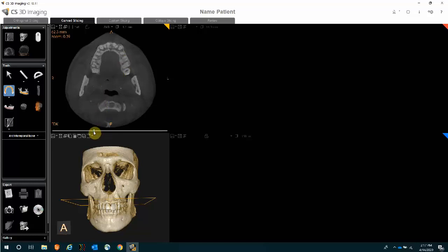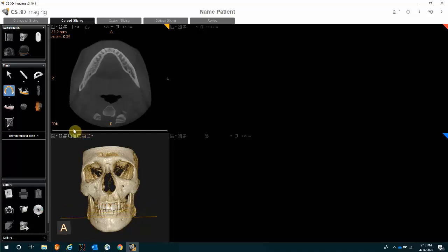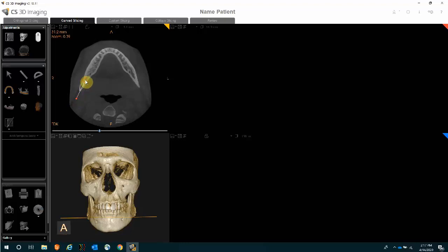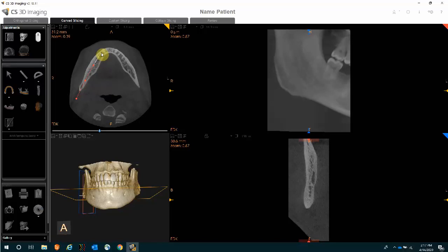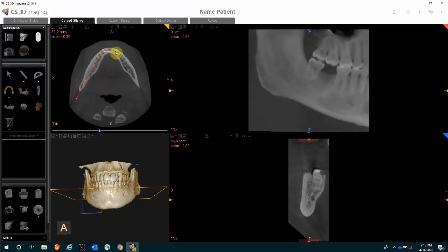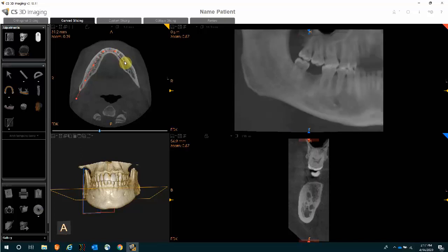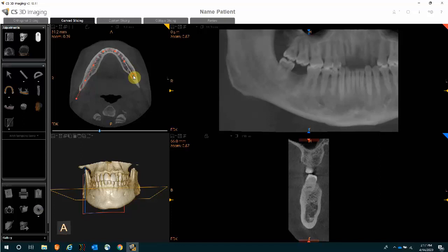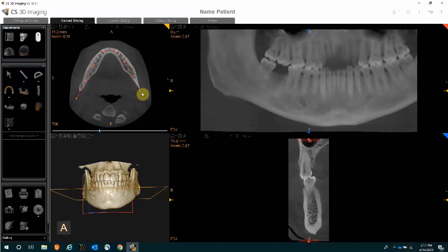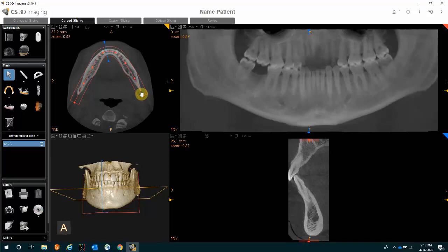If you're placing an implant in the lower arch, as we'll do in this example, slide the slider bar to the lower arch. With the arch creation option still selected, simply start clicking between the buccal and lingual on either side. As you do, you are automatically creating that panoramic view on the right-hand side, along with a cross-sectional view. Simply double-click when you get to the end, and you are presented with a panoramic view.